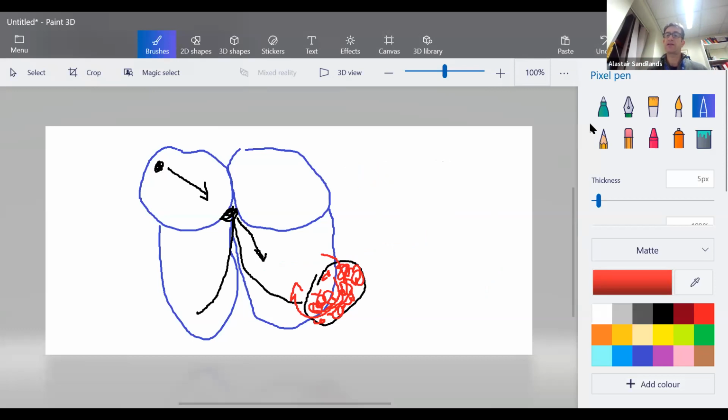is that the sinus node hits the AV node, the VT is slowed down within its scar, so it hasn't come out of the scar yet. It hits the AV node, and it actually conducts all the way down both the bundles, and therefore gives a capture beat. So it's captured the ventricle fully, capture.